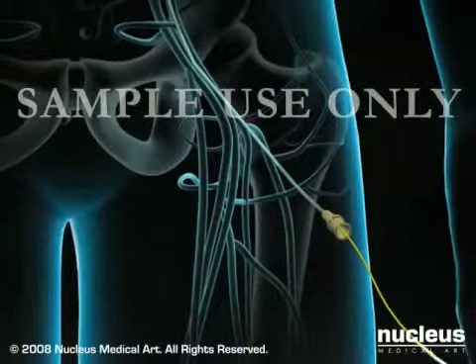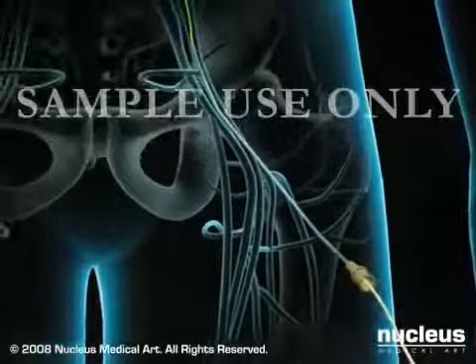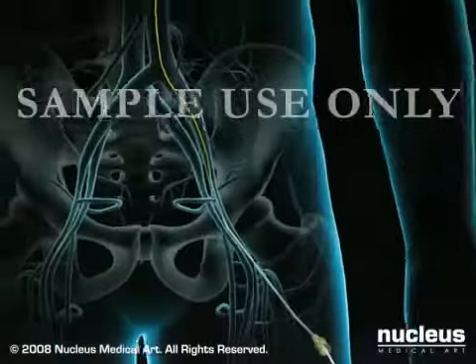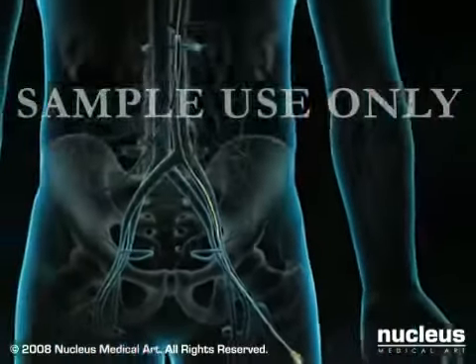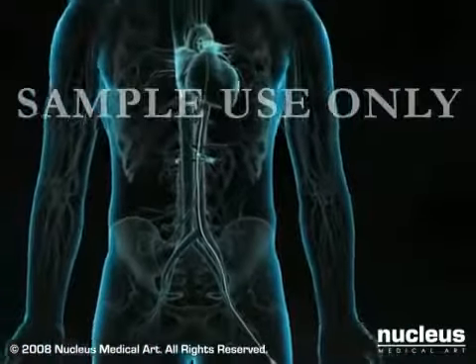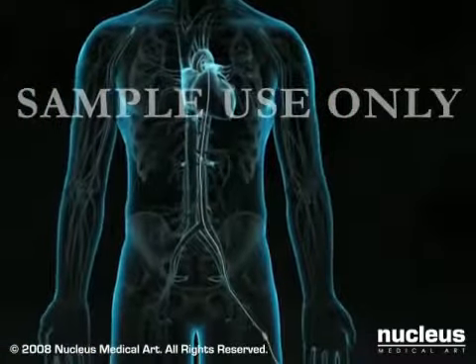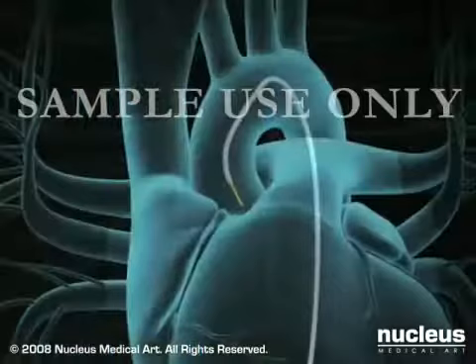Next, a soft, flexible catheter is slipped over the wire and threaded up to the heart. The procedure is monitored using a continuous x-ray imaging device called a fluoroscope. You may feel pressure as the wire and sheath are inserted through the groin and pushed through the artery, but you will not feel their movement inside your arteries.